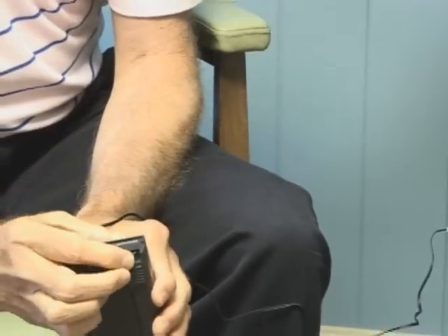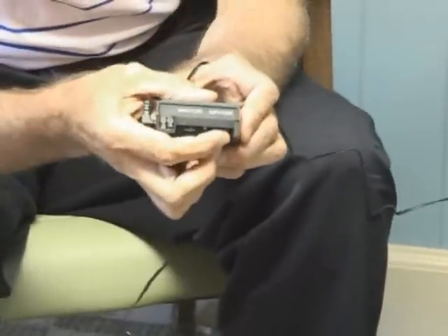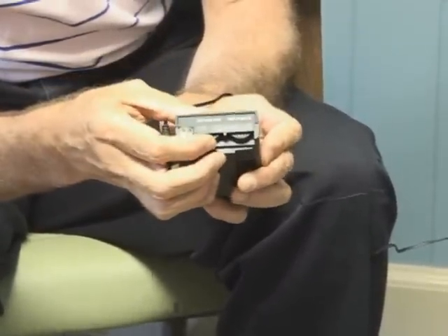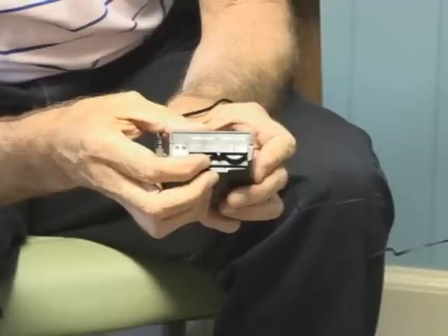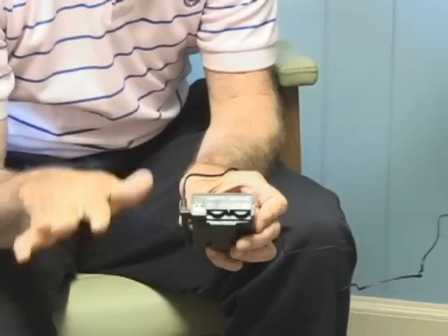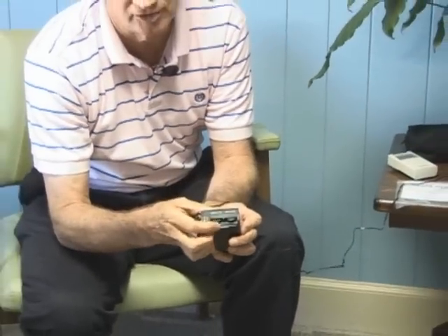You turn it on at the top — it's called amplitude, which is the power. Turn it on and adjust it to where it feels okay. What I mean by feels okay is that your pain has been subdued — it's not as bad as it was. Then you adjust the other channel.